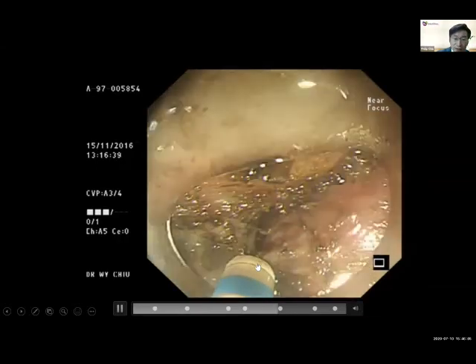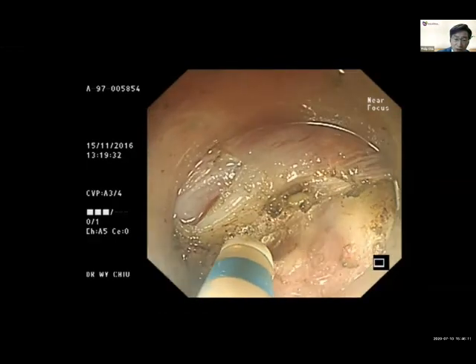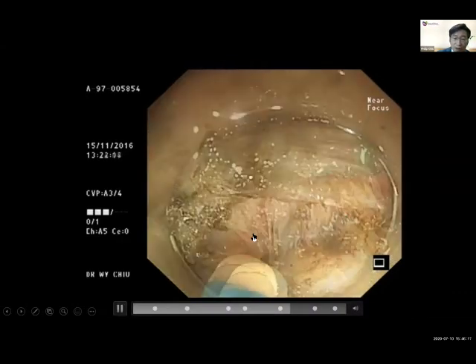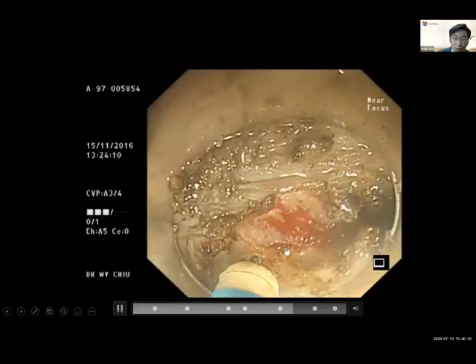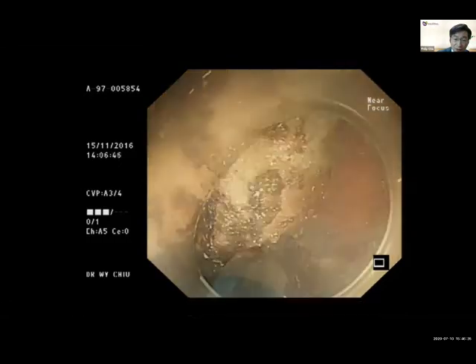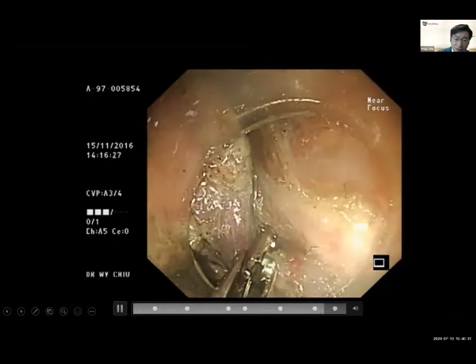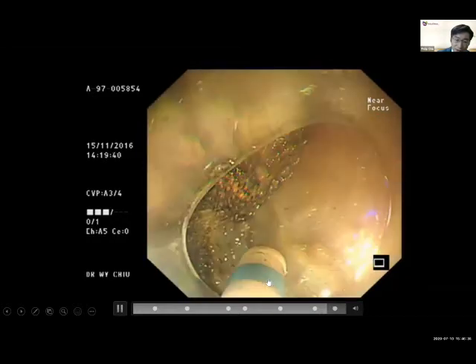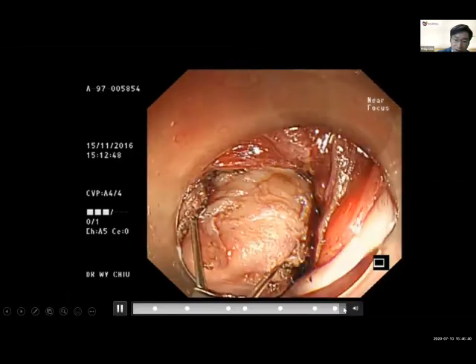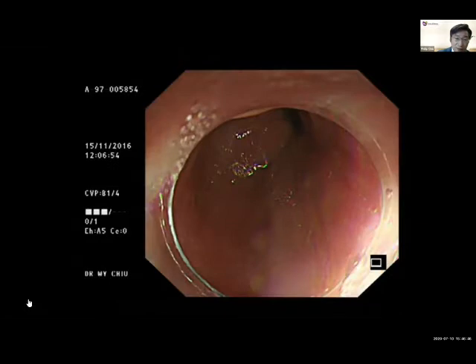In the esophagus, most of these tumors are leiomyoma, so we are not too worried about the resection margin. But for some submucosal tumors in the stomach, a lot of the time these are GIST tumors, so we are more worried about an incomplete resection with an inadequate resection margin. After completion of the dissection, the final part is the most difficult because the tumor is free from surrounding attachment, making it difficult to manipulate. But finally, we can take this out from the mucosal entrance site and then complete the mucosal closure with clips.